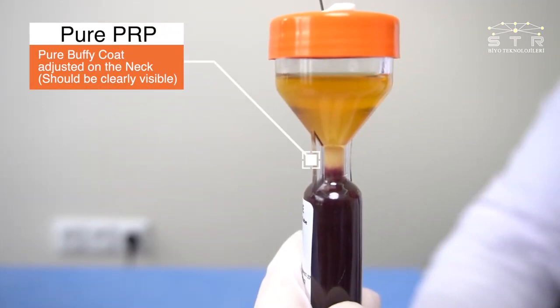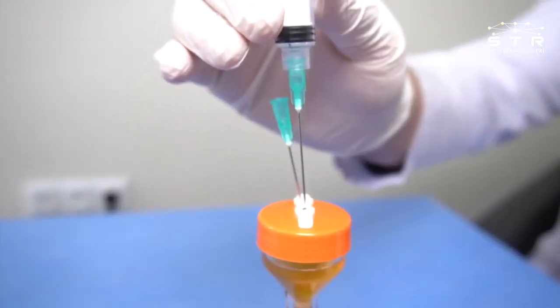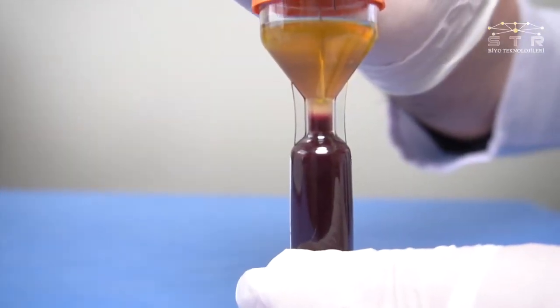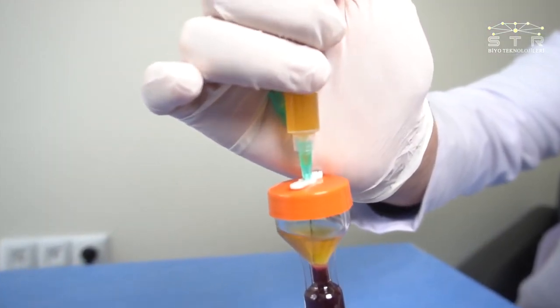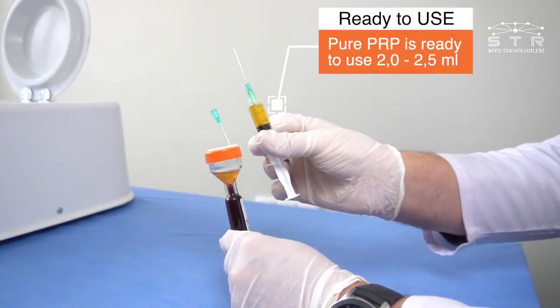Pure buffy coat adjusted on the neck should be clearly visible. Take all buffy coat by circulating the tip of the needle. Pure PRP is ready to use: 2 to 2.5 milliliters.